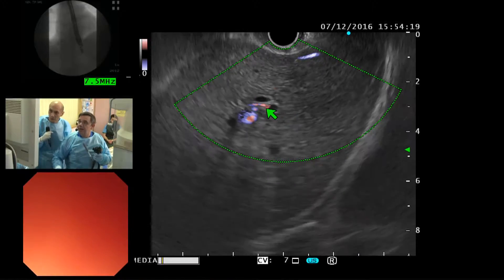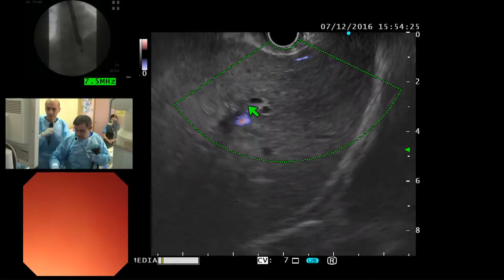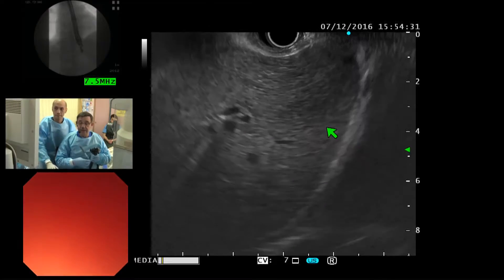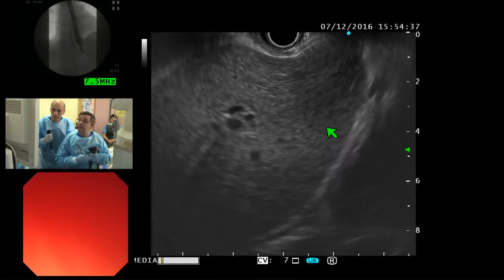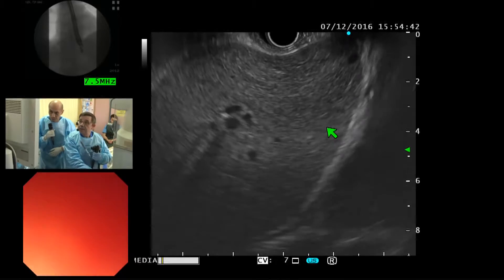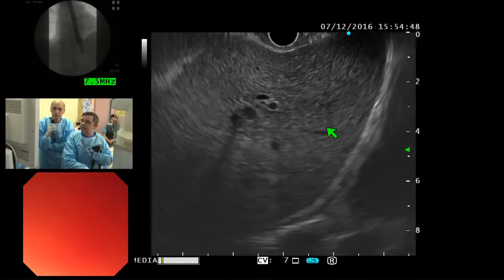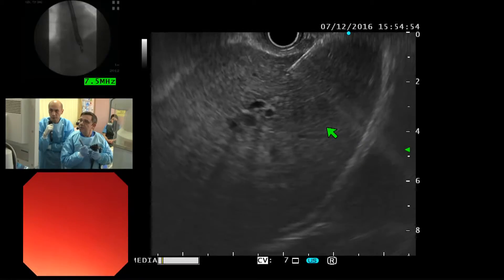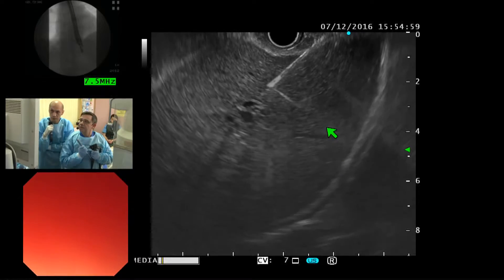I will try to target and obtain a cholangiogram of this, and after we will see if it's possible to put a wire in. I'm using the standard 19-gauge needle. It's a little bit too far — into the drain. So it's decompressed. Now I try to target this very small duct — it's very difficult to target such a structure.